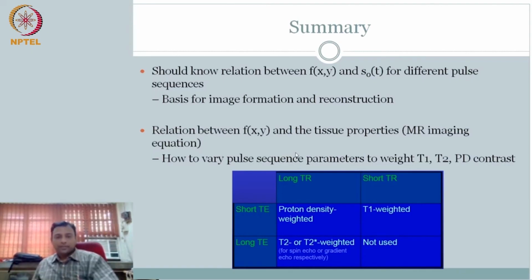Okay, we'll stop here. What we still need to cover is, from here it is a little straightforward. From here what we need to cover is, I have the data, how do I get my image, right? You know, inverse Fourier transform. So conceptually, from here nothing should look new. We'll just formally complete it, but from now, image reconstruction should be a cakewalk if you understand this, because we have done this for CT. Here we have understood what we are recording, which is the Fourier transform of the object. So I should be able to go back to the object or the image. I should be able to obtain the image.